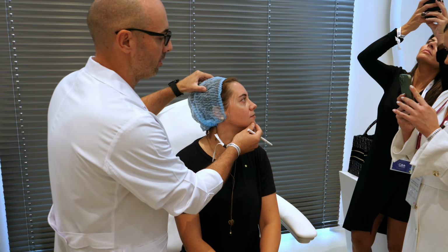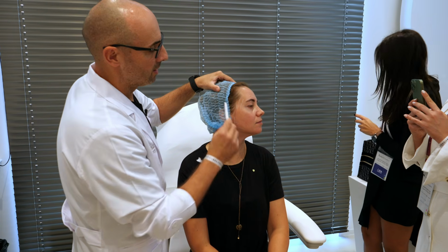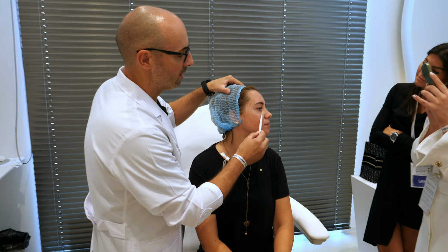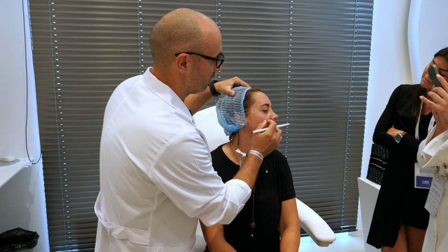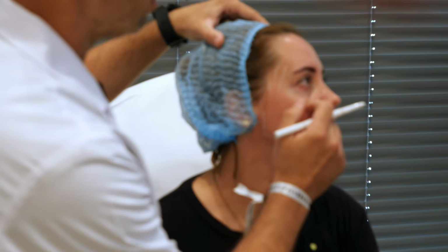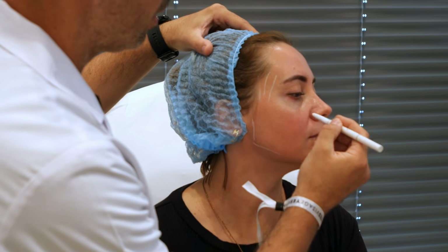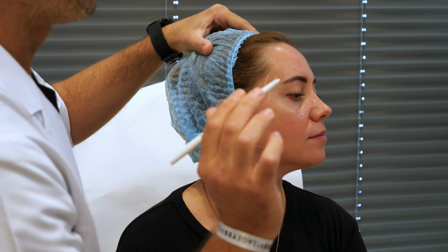In the lateral plane, we observe another depression. She has a little negative vector here, and she has lost the deep fat here, okay? This zone is marked for possible treatment, okay?